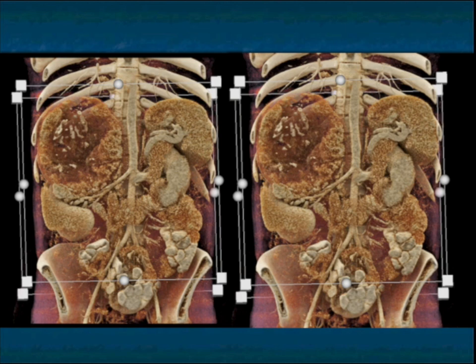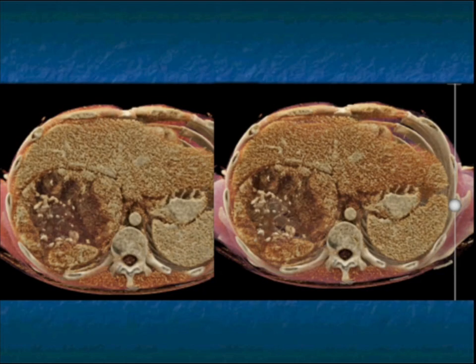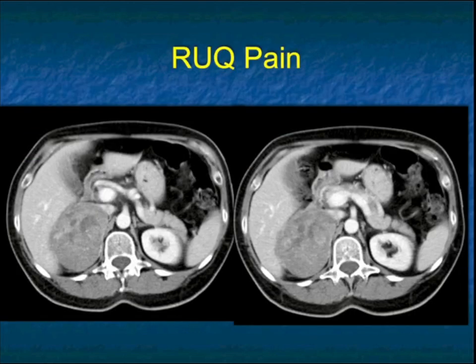It kind of looks classic, that central necrosis, the calcification, the solid components around the periphery of the lesion, the size of the lesion, the growth up to the diaphragm, the way it pushes the kidneys down, are all really good signatures of primary adrenocortical carcinoma. And I'm showing you a number of different images, as I promised in the beginning, because I think it's very valuable to see this information.